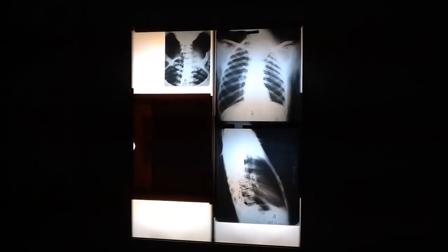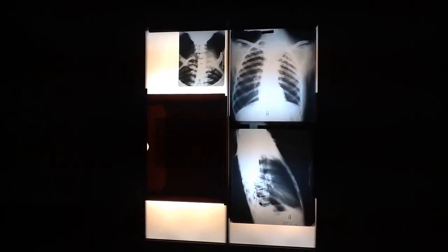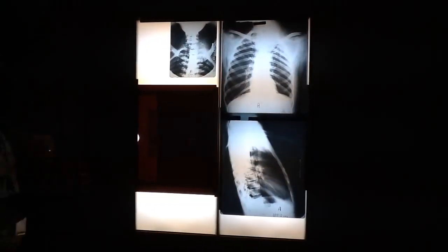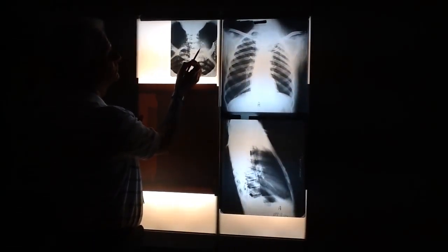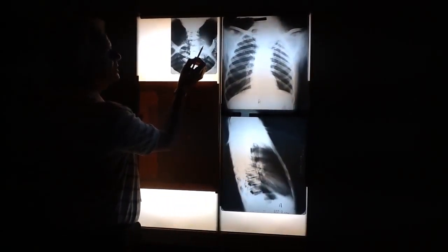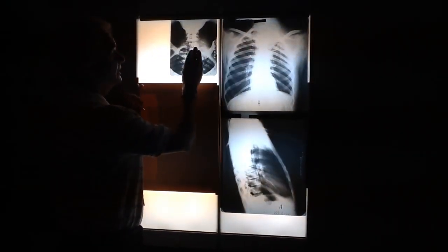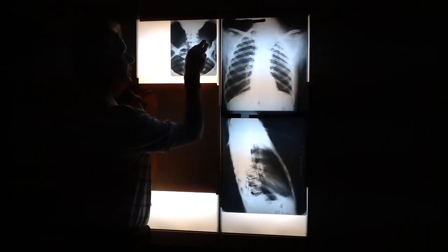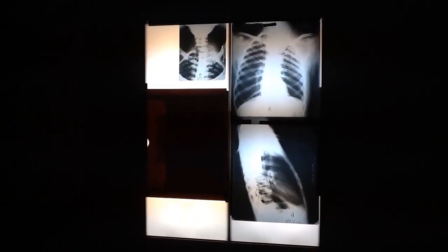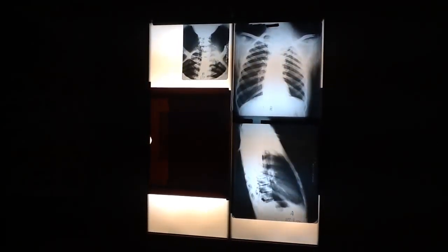Yeah, and which way is it going? Away from the density. Away, so what does that mean? Being pushed. Something's getting bigger and it's pushing the trachea out of the way. So we have a mass in the apex. What's happened to the first rib? Pushed up. Destruction. It's destroyed. Look at over here. We've got osteolytic destruction in that rib. It's just destroying the rib because this has spread into the rib cage. It's expanding, it's pushing this. If it's pushing the trachea, could it compress the esophagus? So they may be complaining of swallowing issues, dysphagia.